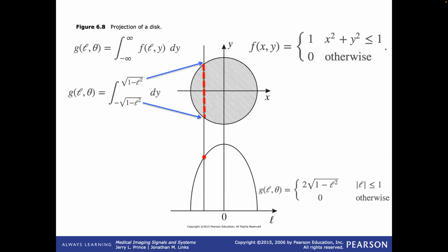So we'll put in ellipsoids, and then when I'm doing my simulation, I know precisely what the analytical function is that's going to hit my detector. So you can simulate it absolutely precisely, as opposed to doing it ray by ray, which is susceptible to some kind of integration errors and things like that.